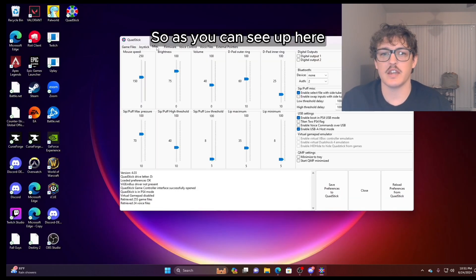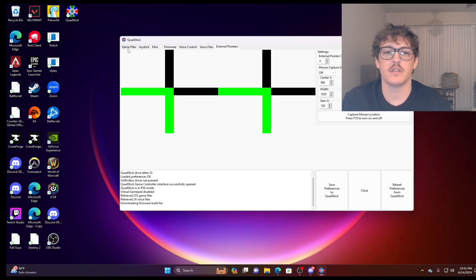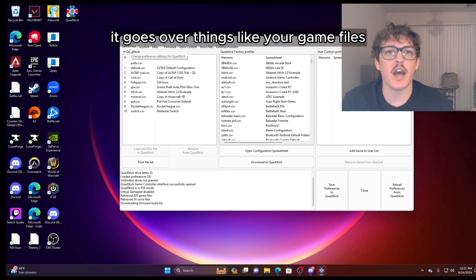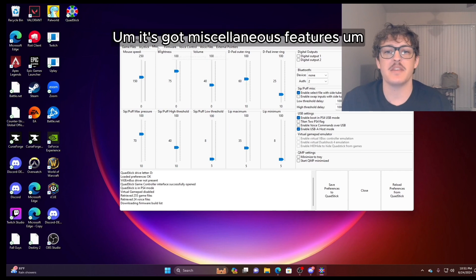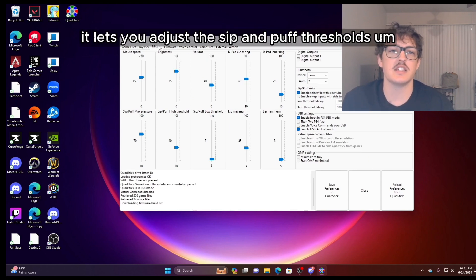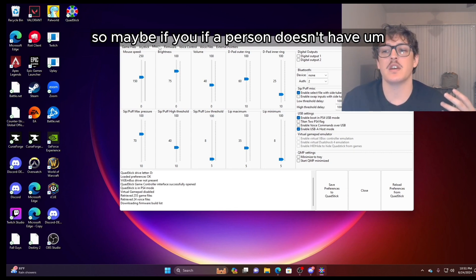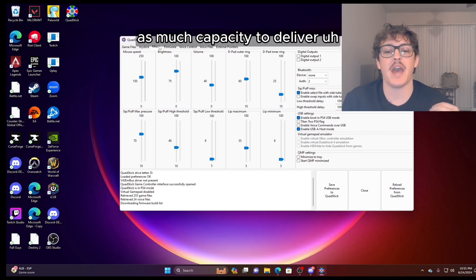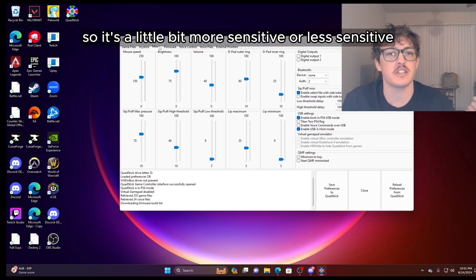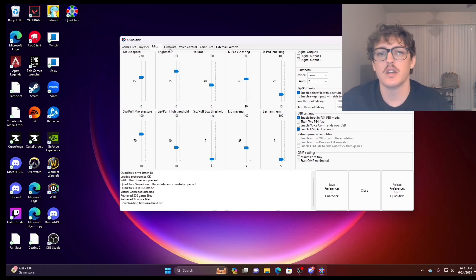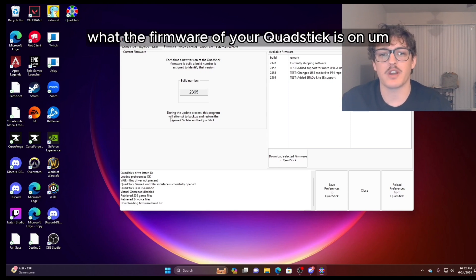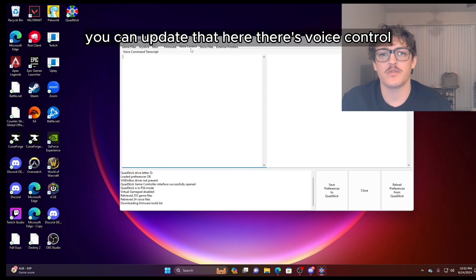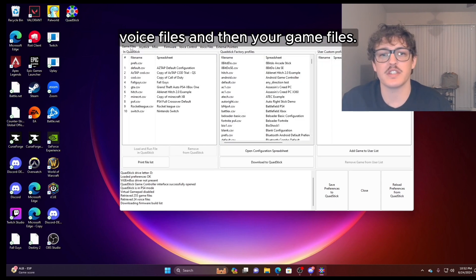So as you can see up here, there's a bunch of different tabs. It goes over things like your game files, your joystick, so it lets you customize your joystick. It's got miscellaneous features, and it's got a bunch of different things like the brightness of the LEDs that lets you adjust the sip and puff thresholds. So maybe if a person doesn't have as much capacity to deliver a puff with enough pressure, you can adjust the threshold so it's a little bit more sensitive or less sensitive depending on the control of the user. There's firmware, so what the firmware of your QuadStick is on, you can update that here. There's voice control, voice files, and then your game files.